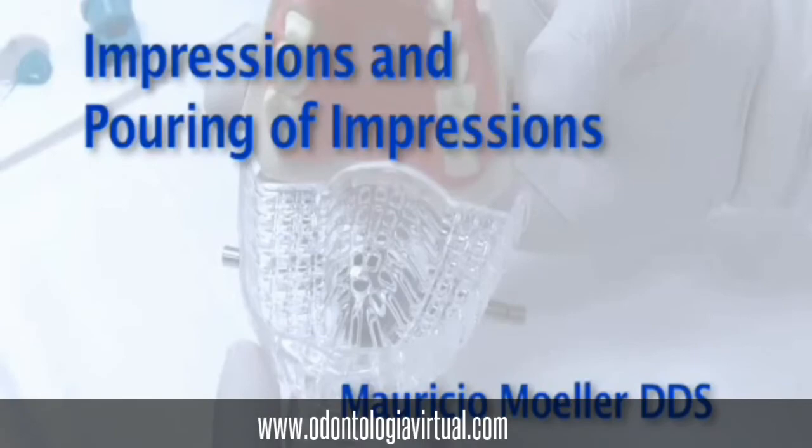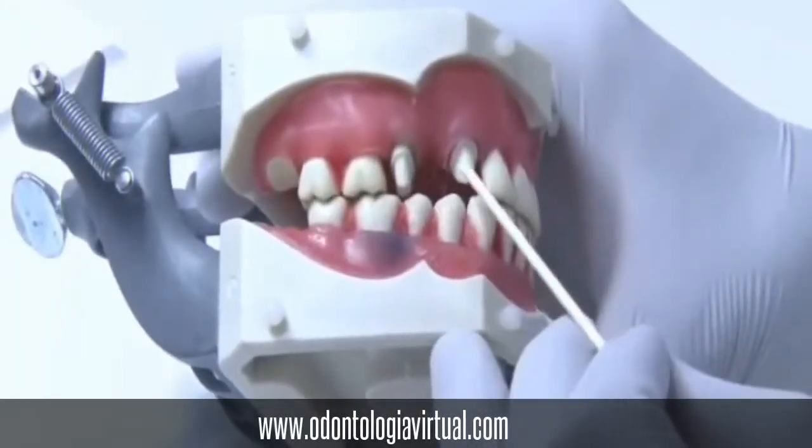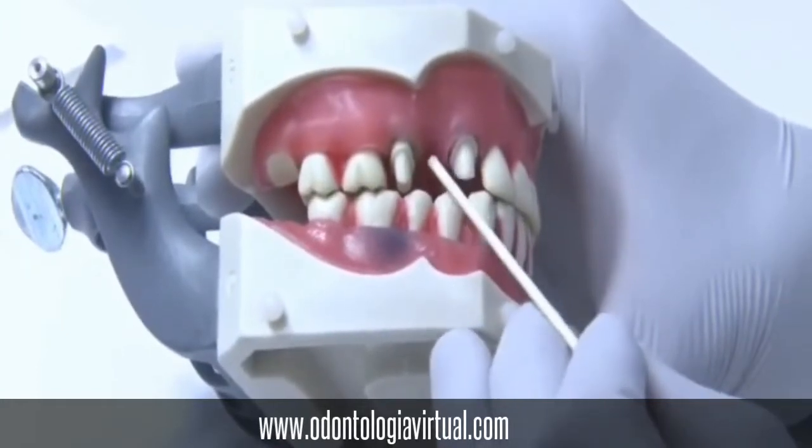Session number 13: Impressions and Pouring of Impressions. We will be making maxillary and mandibular PVS impressions of your typodont with edentulous spaces in the 5 and 20 areas.